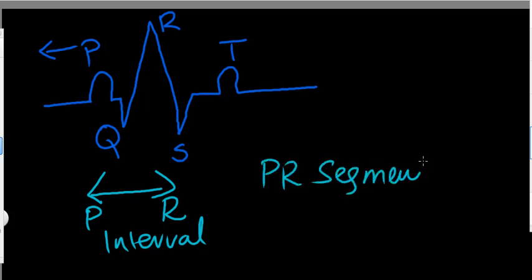But first, we are going to be talking about the PR interval.